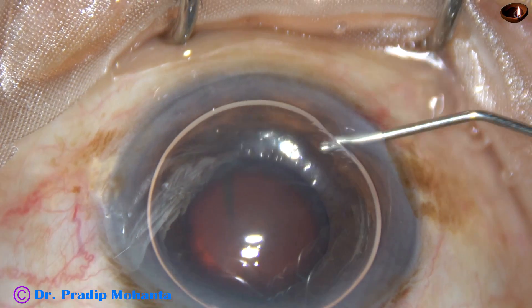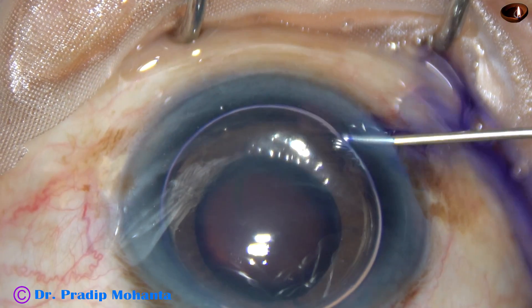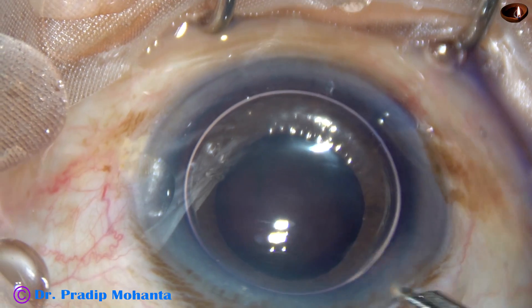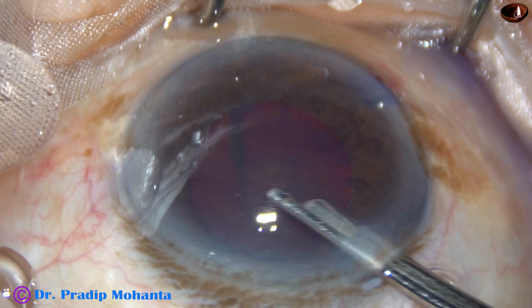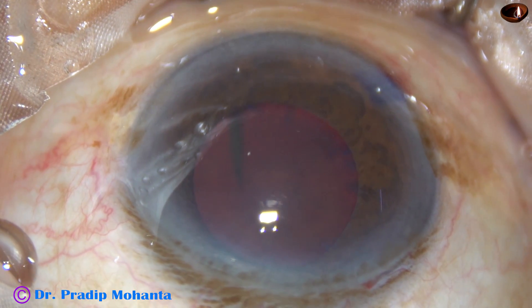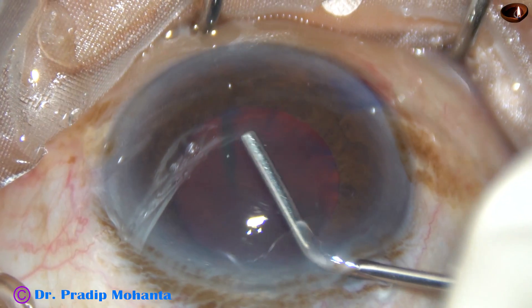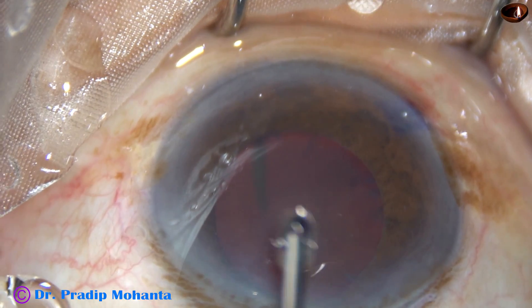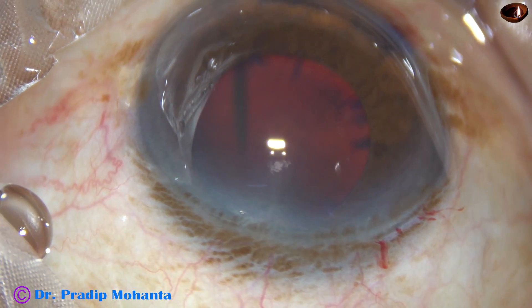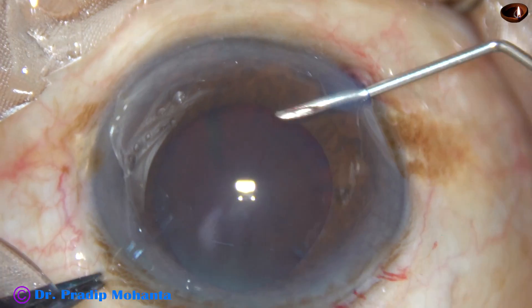I have taken up this case for surgery. By this time all the incisions have been made and now the anterior capsule is being stained with trypan blue dye. A little bit of adrenaline has been applied. The dye is washed out and we can see that the pupil size is okay — about six millimeters — and if this dilatation remains, the surgery should not be any problem. Visco is applied over the corneal epithelium, but not so much that it overflows onto the sclera.